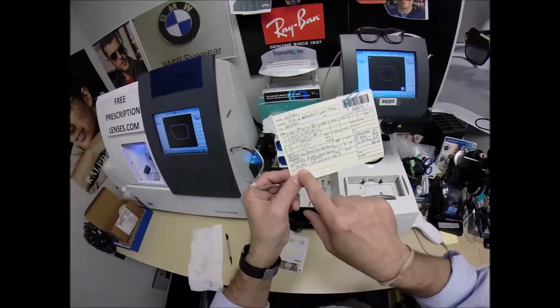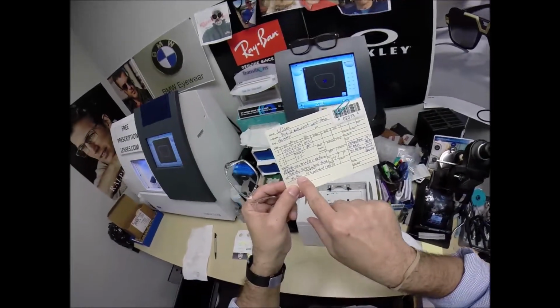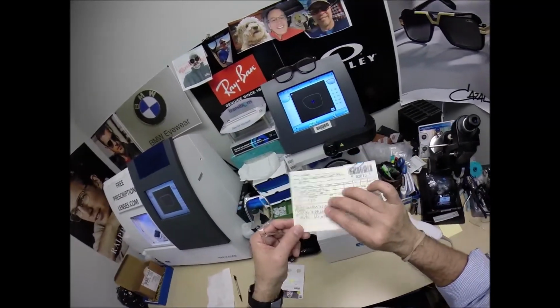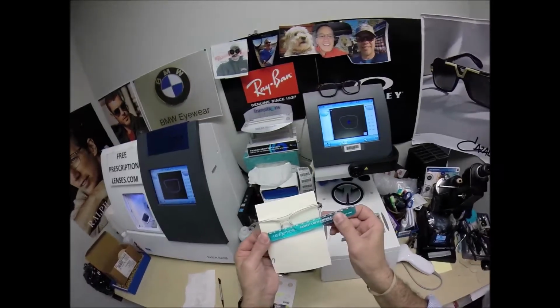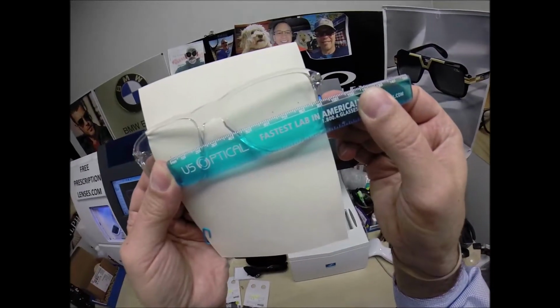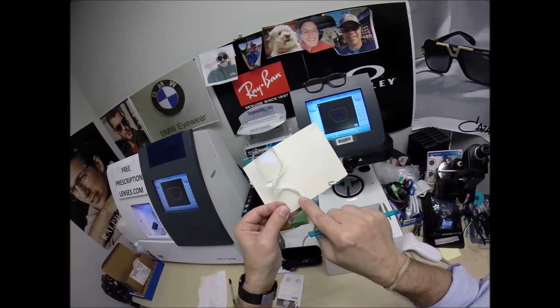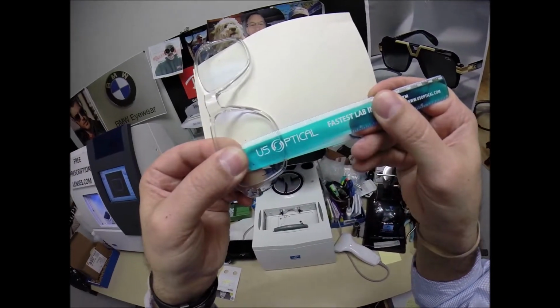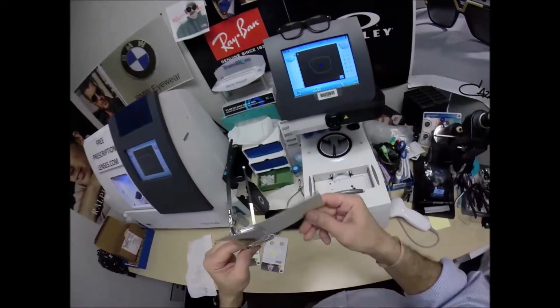So take that out. Now the last part of the final inspection, measure your pupillary distance and the optical center. 32 for your right eye, 32 for your left, for a total of 64. Optical center height of 22. Turn the card around, place the PD stick against my thumb on your right lens. When we hold it up to the left lens, we're getting 64 millimeters, so that is cut perfectly. Not to the bottom of the lens, but to the middle of the plastic. It's going to be 22 millimeters. That is cut perfectly.